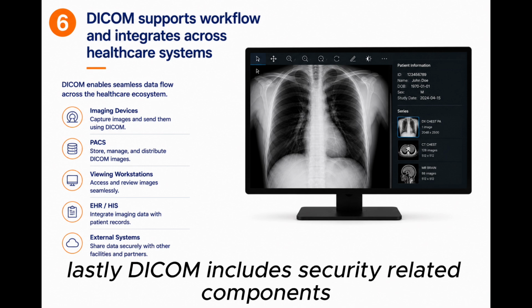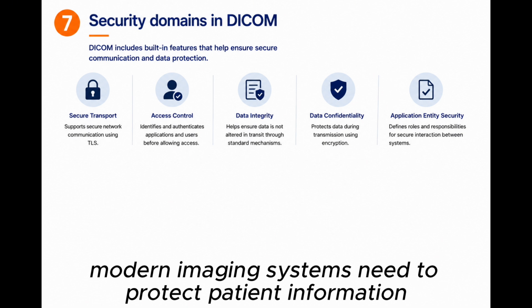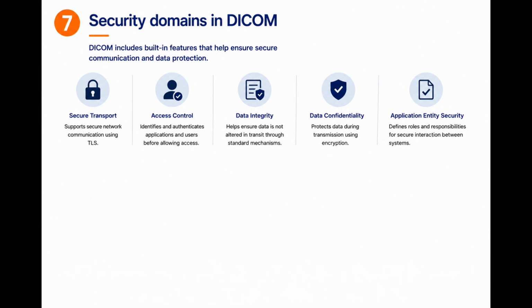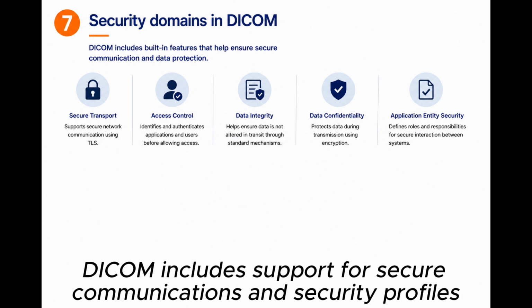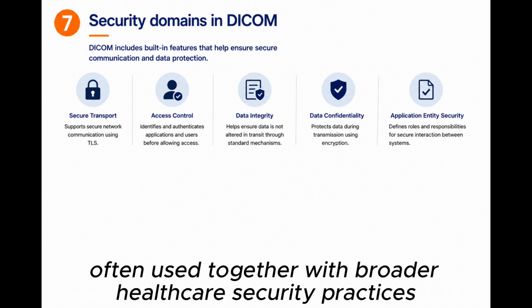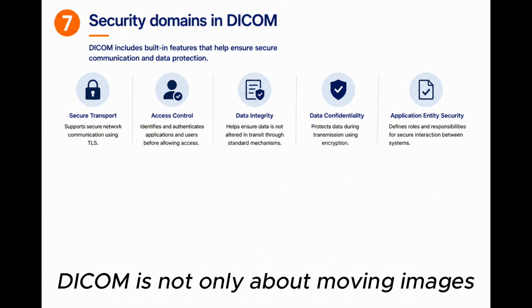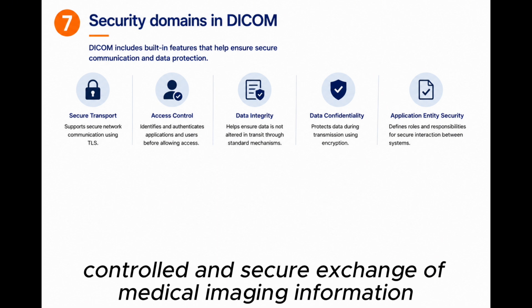Lastly, DICOM includes security-related components. Modern imaging systems need to protect patient information while allowing images to move between systems. That's a bit of a tall order, but that is where security comes into play. DICOM includes support for secure communications and security profiles, often used together with broader healthcare security practices. The key point here is this: DICOM is not only about moving images, it also has to support safe, controlled, and secure exchange of medical imaging information.